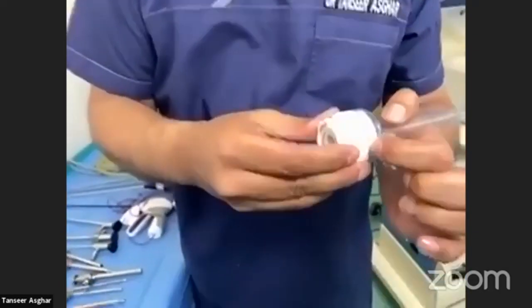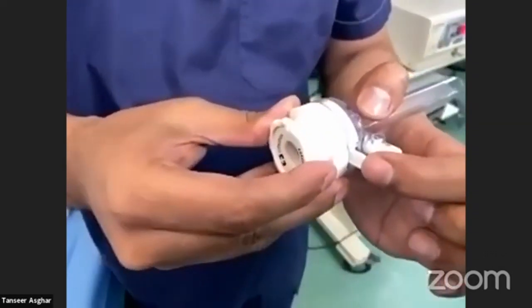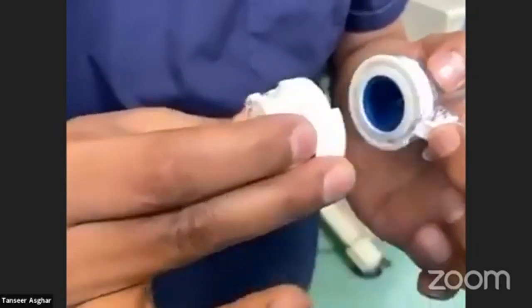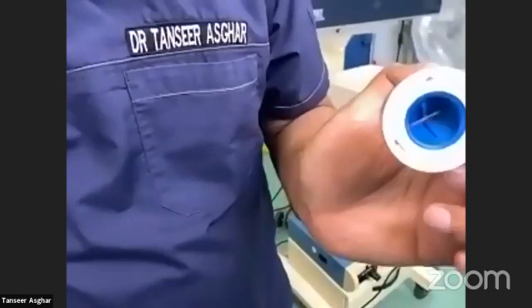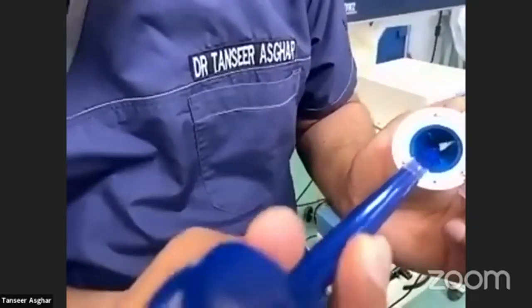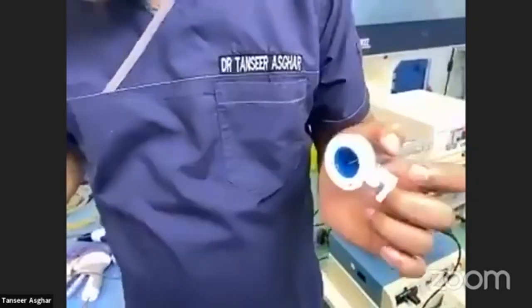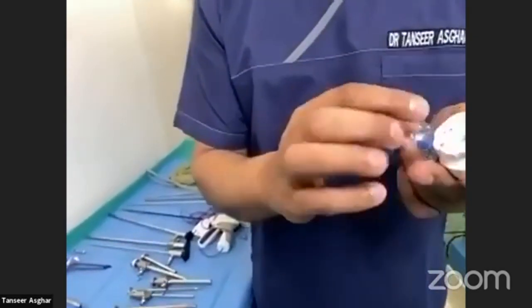There are different types of mechanisms in the cannula. In this one, you push down a button and rotate it to open. There is a valve here which stops the carbon dioxide from escaping, and another safety valve through which instruments can enter.